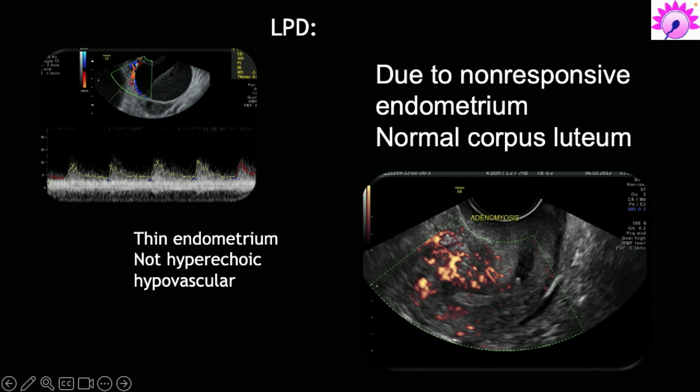Of course, we will discuss this more with the baseline scan, but if you have a follicle which has grown beyond 14-15 millimeters but does not show flow and everything else looks normal, that is when you need to add 1 or 2 shots of LH, and that will improve the vascularity and the quality. This is only because of the polymorphism. So, it is very important to understand why we are doing the luteal phase scan.